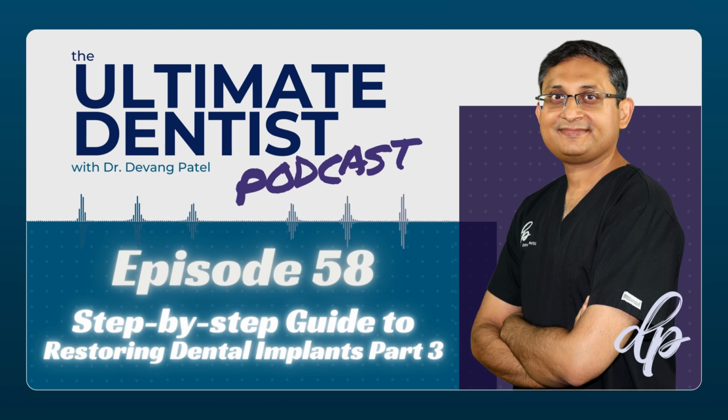The problem with that is there is a risk of peri-implantitis from cement, which means inflammation of the peri-implant tissue because of the remnants of cement left over. If the margin is subgingival and you have excess cement, the tissue around the implant doesn't like it, and then your patient gets bone loss, inflammation, and failure of the implant.